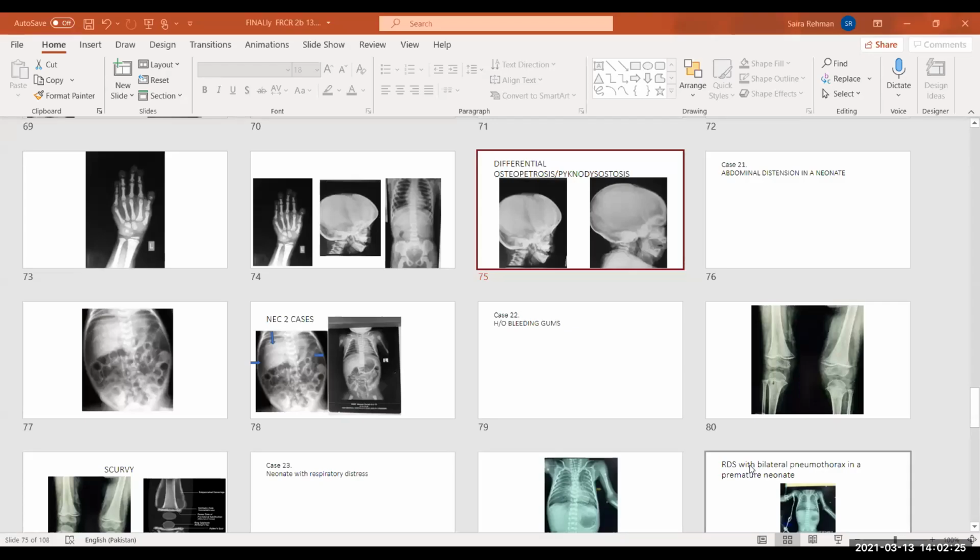If there is so much obstruction, or there is ischemic bowel, or we can see a toxic megacolon, of course we won't do that. But usually the patients that come for barium enema are those with chronic constipation, and we don't do the full protocol for those patients.